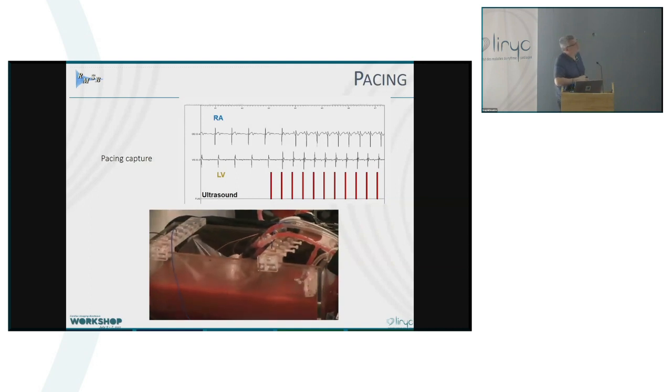So this is an example of a beating heart of a pig, and then we are going to send ultrasound pulses, and what you see here is that you can force the heart to beat at the frequency of the pulses you are emitting.